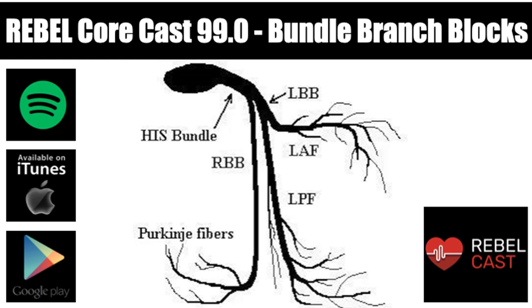So obviously the left posterior fascicular block, an old lateral wall myocardial infarction, acute pulmonary hypertension, again like you see in a pulmonary embolism, chronic pulmonary hypertension, sodium channel blocking drugs, hyperkalemia, RV hypertrophy, and misplaced leads. Again, this is all pretty visual, so you really need to match the audio with all of the images that we've got on the website.